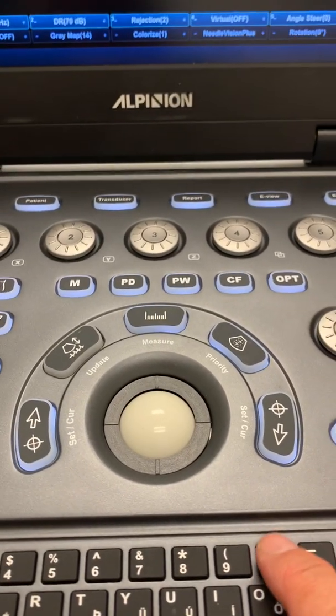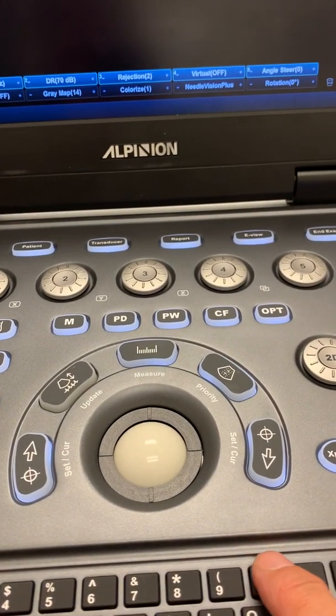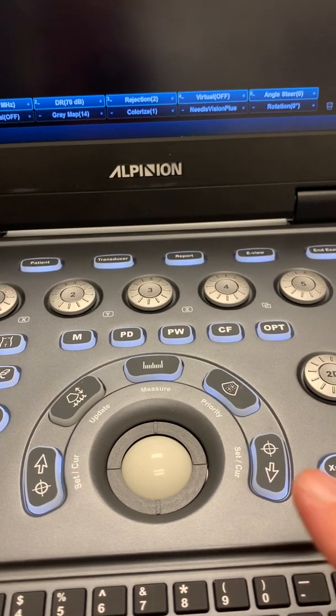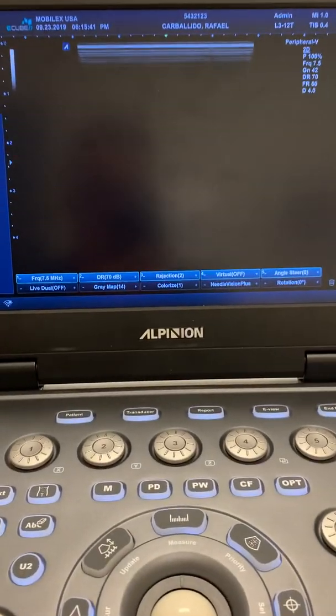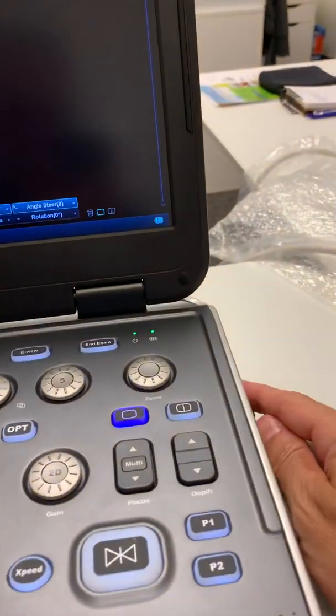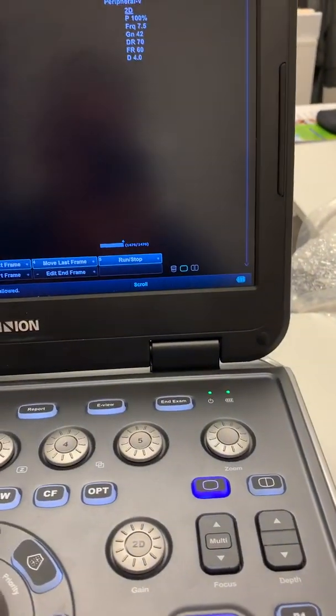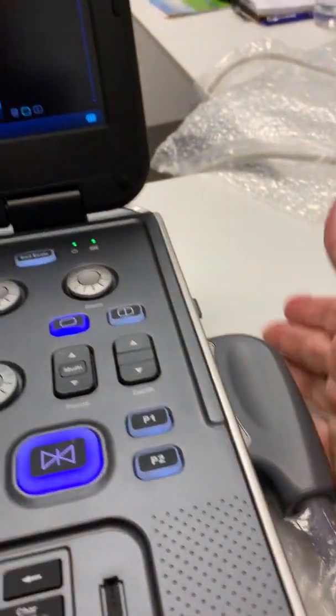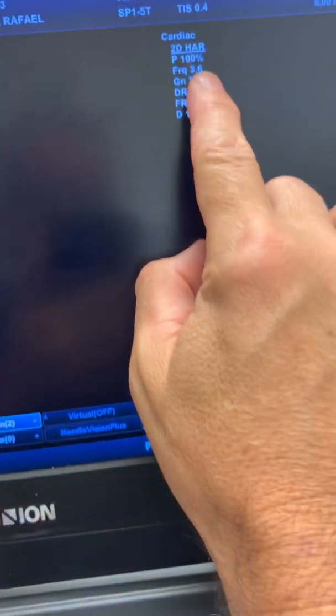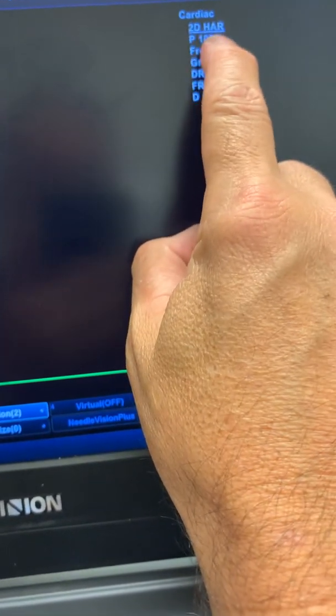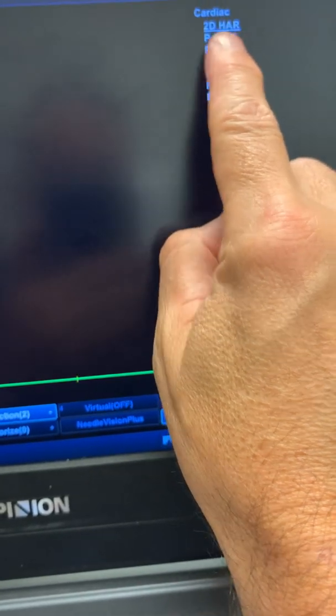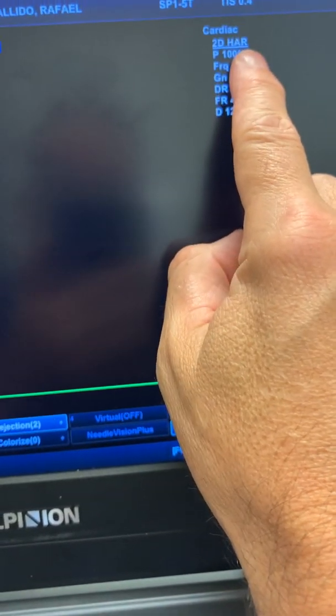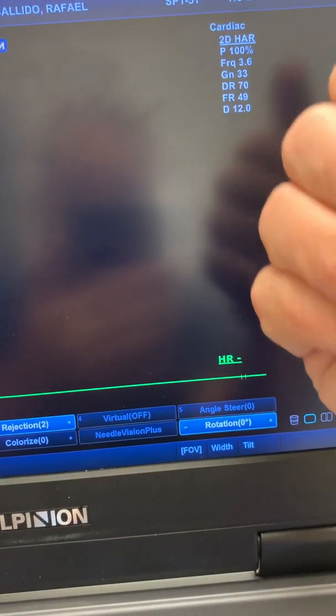The machine will automatically go to harmonic when it's actually needed. Let's say I'm using the cardiac probe. When I connect the cardiac probe, the machine will go to cardiac and then it will show you here H A R. That means the machine is already doing harmonic.